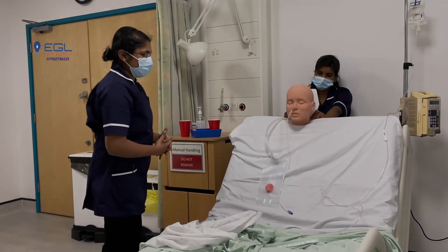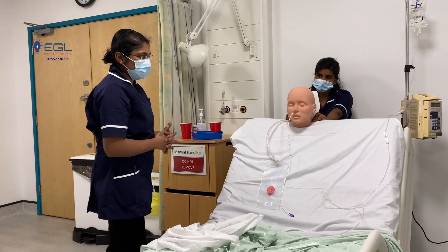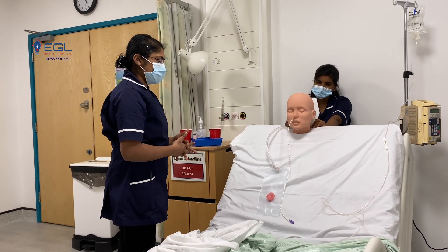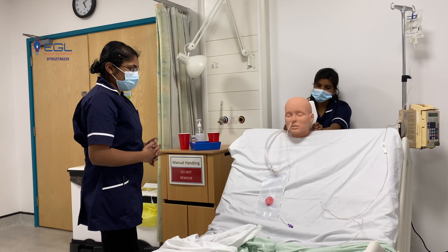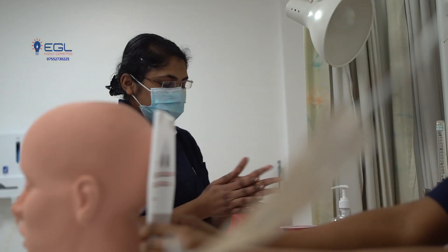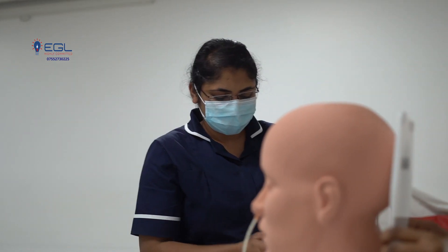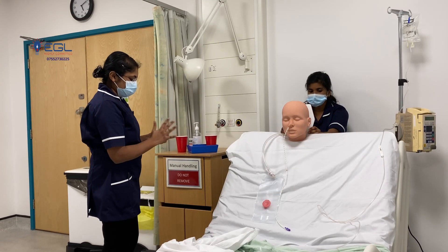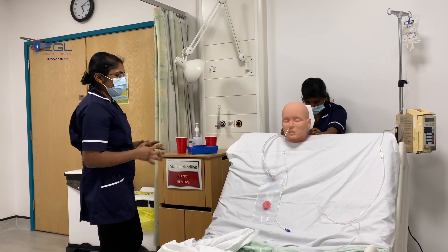Okay, I have completed the procedure. Are you comfortable now? Yes. If you have any concerns, you can press the buzzer — we are here to help you. Okay. I will wash my hands. Thank you.